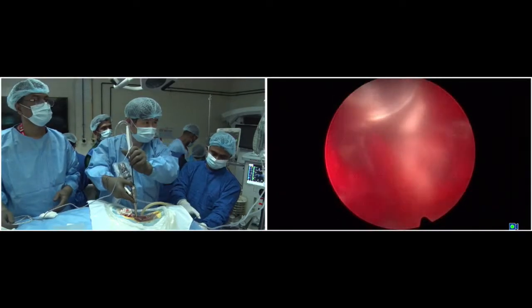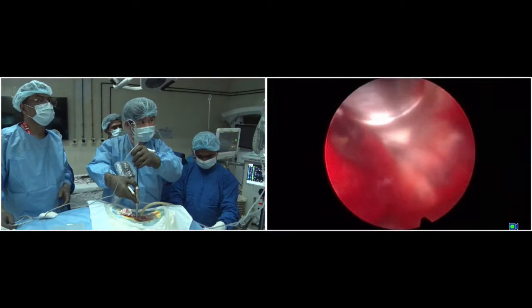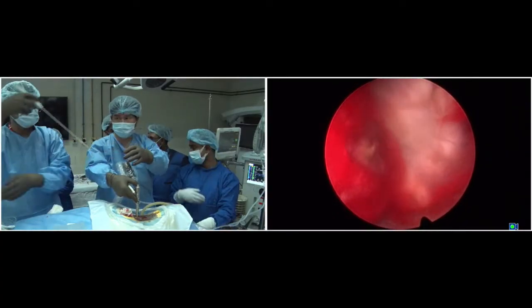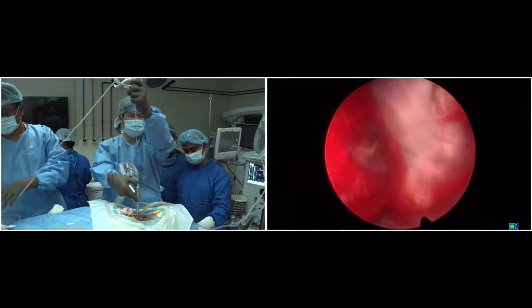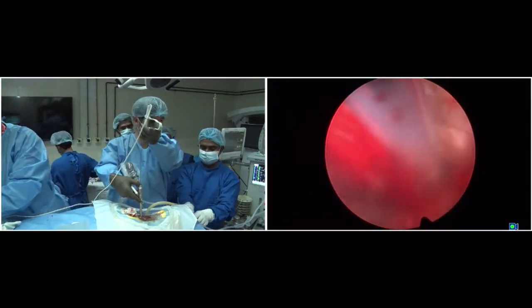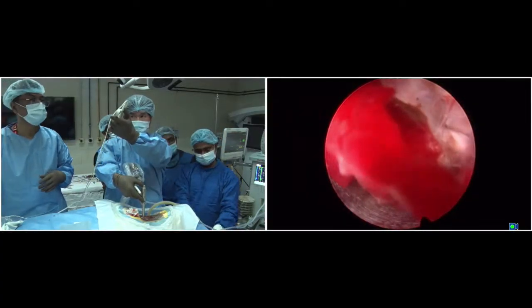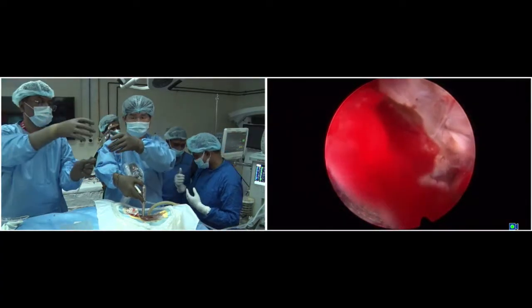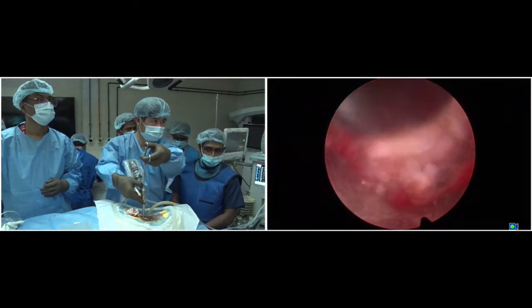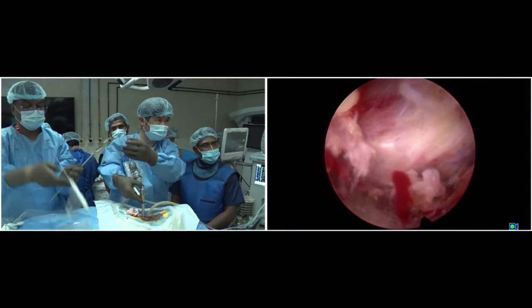Now play. No, not working. Change. Force, please. Force. RF.